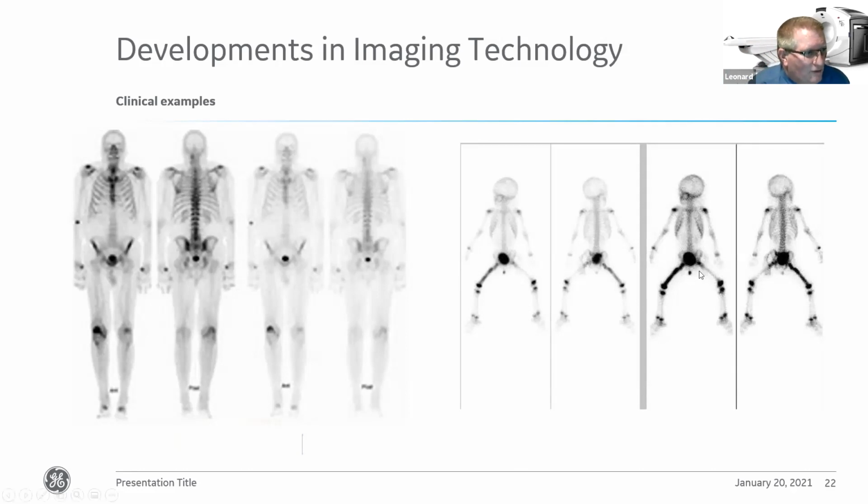And that's where this proximal femoral fracture is shown. And then this increased significant intense uptake within the rest of the femur across its length is actually more indicative of a Ewing's tumor. So this is a Ewing's tumor that then can be treated for the patient.